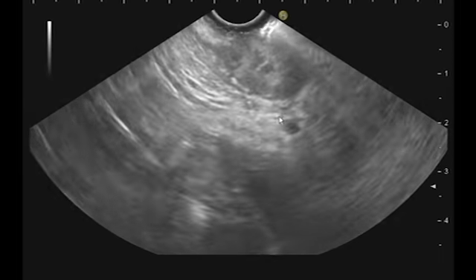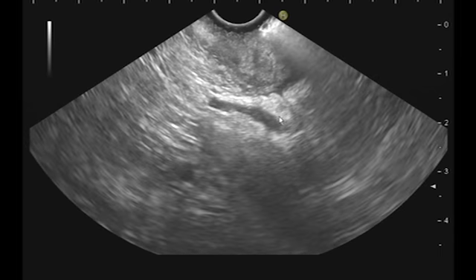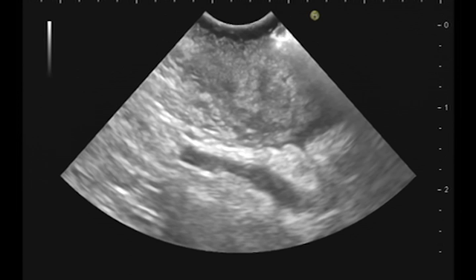Now I will put some water inside the duodenum. Can you give me a syringe of water to have a better view of the lesion? Here you see that this lesion is again an invasive lesion. Here you see this irregular border, with infiltration of the pancreatic tissue, and this is the pancreas with the pancreatic duct, and you see this lesion here.